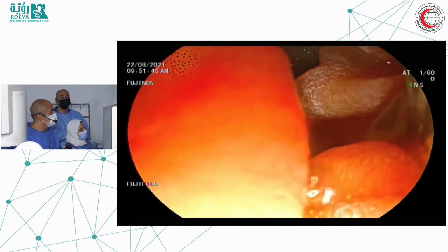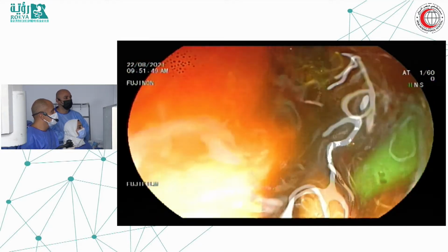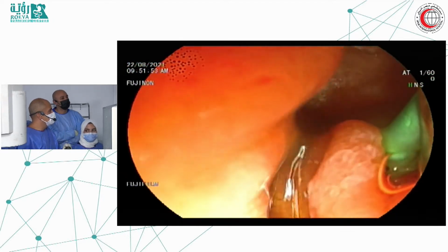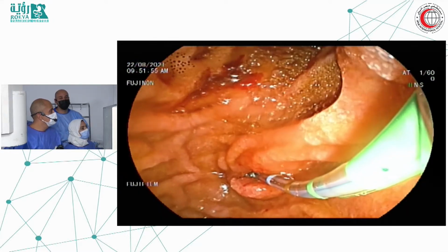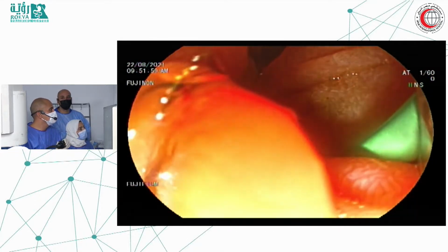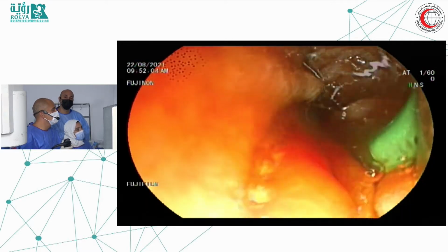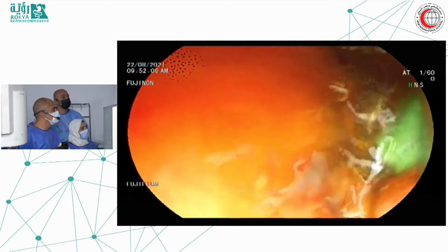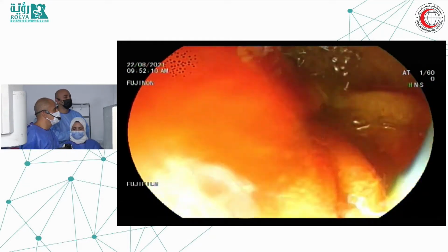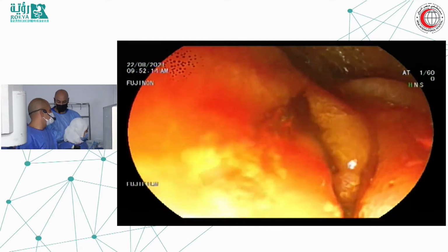This is one of the many differences and fights that Mostafa and I have. He's a very classical endoscopist. He always likes to use a cannula, even though I think many studies have shown that if you use a sphincterotome to do guide wire cannulation, it's actually easier. But again, I think it is a point of debate, and many endoscopists still like to use a cannula. For me, this is a very good debate.